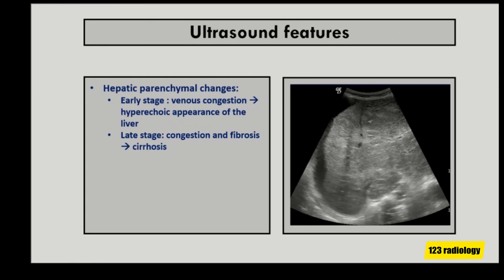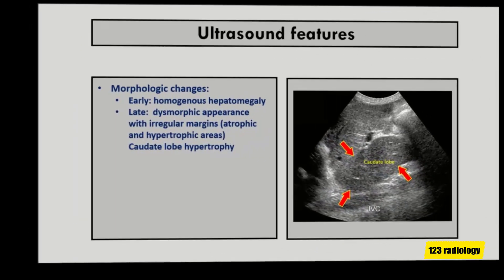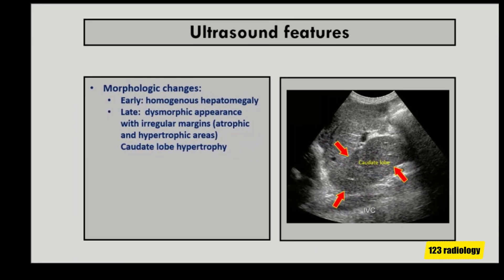During the early stage of the disease, venous congestion is evident, resulting in a hyperechoic appearance of the liver on ultrasound. Later on, in the chronic stage of the disease, in addition to hepatic congestion, fibrosis is present, leading to cirrhosis.